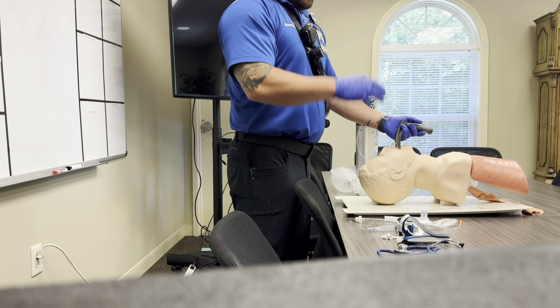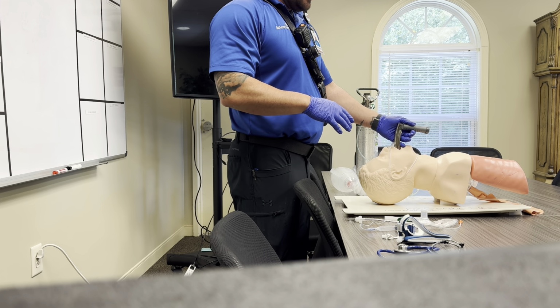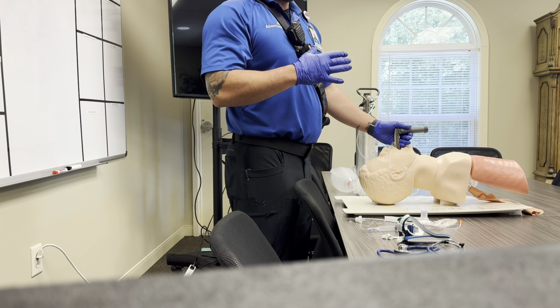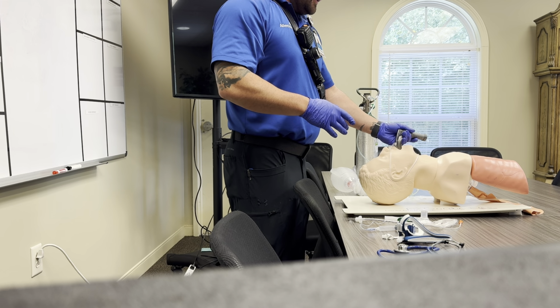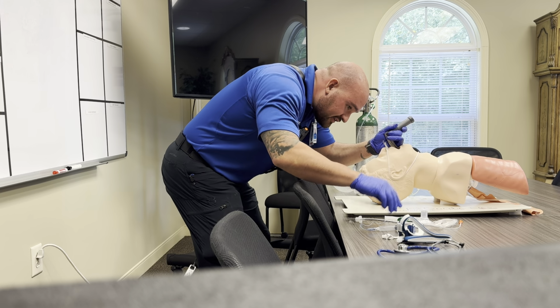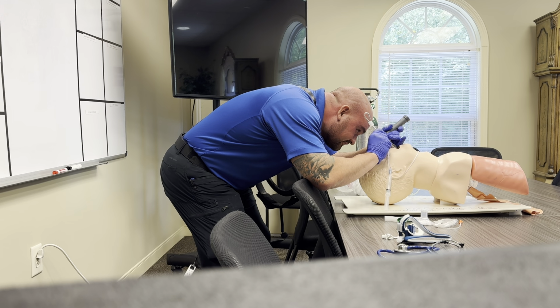Now, the best way to do that would be to place the patient at about a 30-degree ramp on your stretcher. Usually we can pad some of the voids to open the airway enough to be able to correctly view the vocal cords. So we're gonna go in on the right side of the mouth, sweep the tongue to the left, and then without using any leverage on the teeth, we want to be able to view those vocal cords. And I do see them, and we're going in.